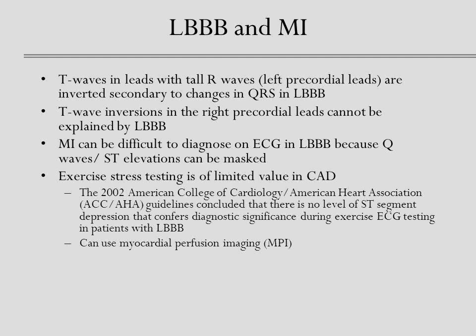Exercise stress testing is of limited value in CAD. The 2002 American College of Cardiology/American Heart Association, ACC/AHA, guidelines concluded that there is no level of ST segment depression that confers diagnostic significance during exercise ECG testing in patients with LBBB. Can use myocardial perfusion imaging, MPI.